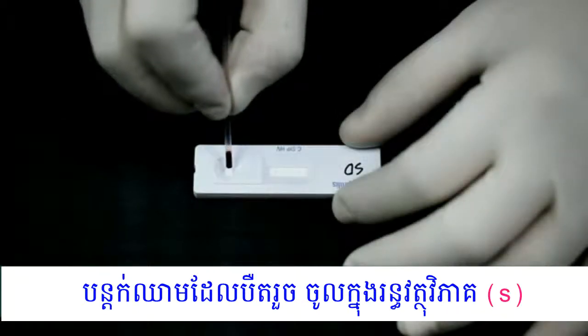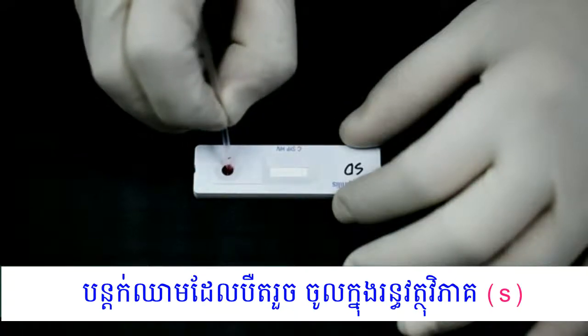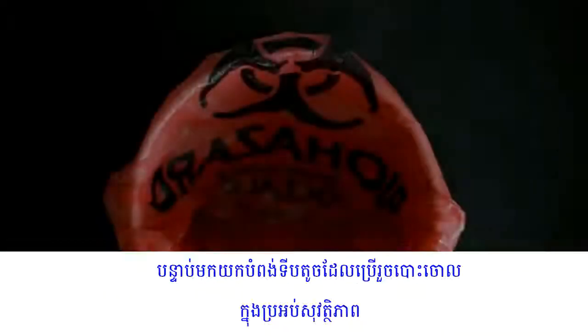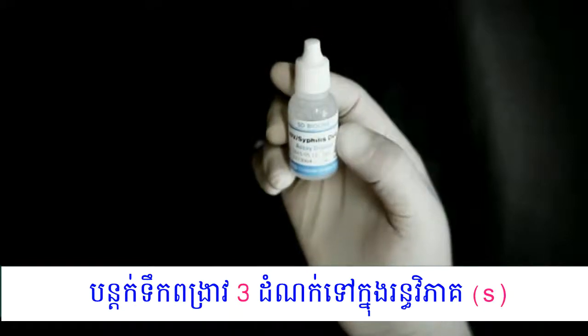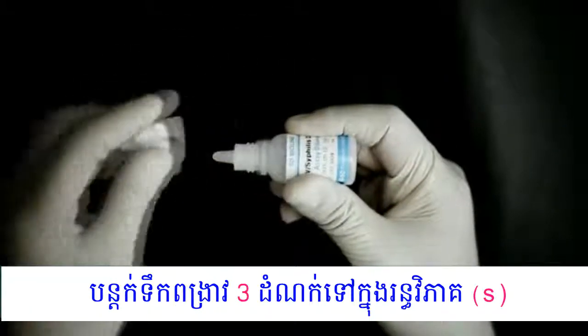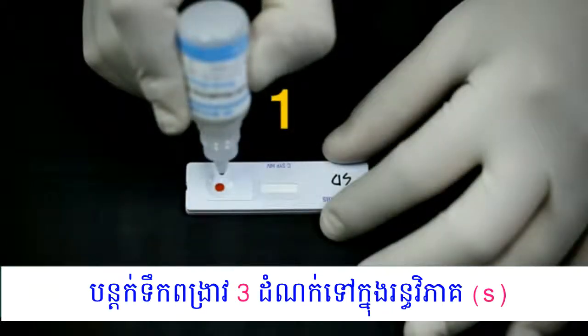Add 20 µL of drawn blood into the round sample well. Discard the capillary pipette immediately in the sharps box. Add three drops of buffer into the sample well — one, two, three.